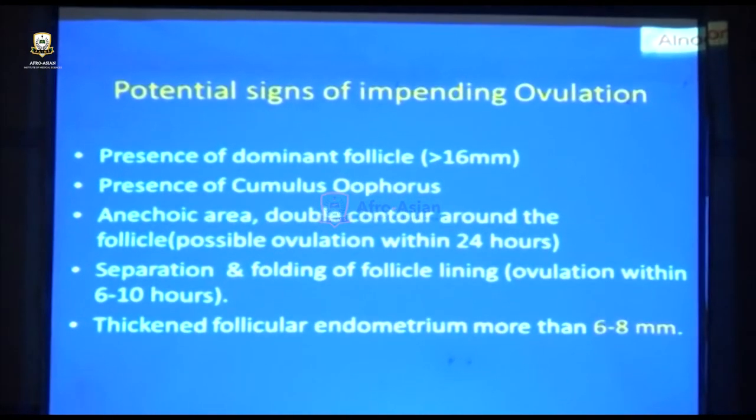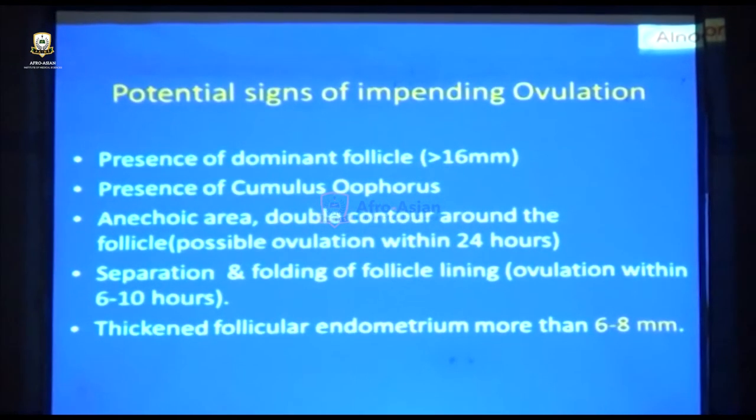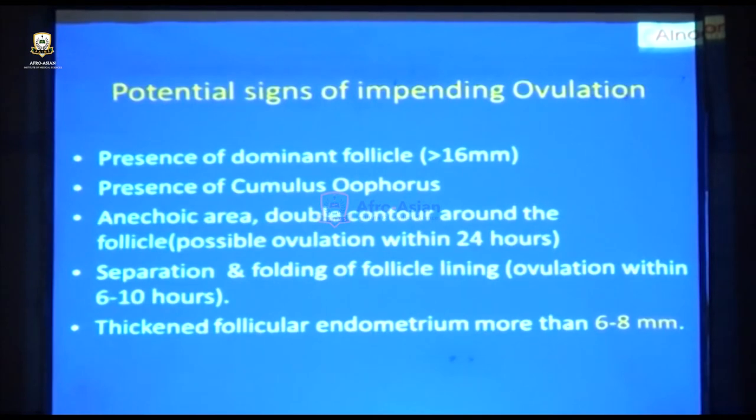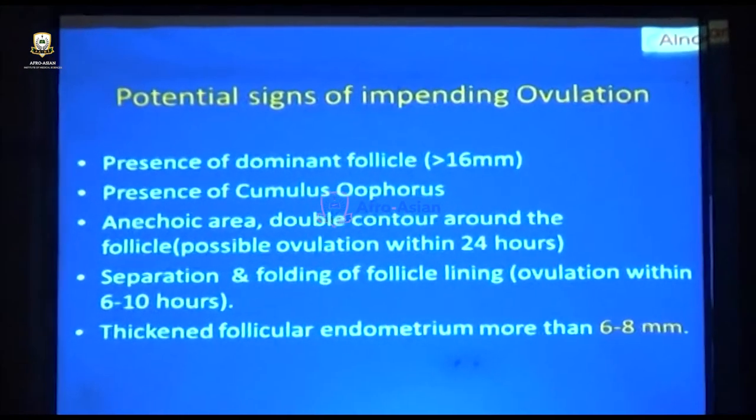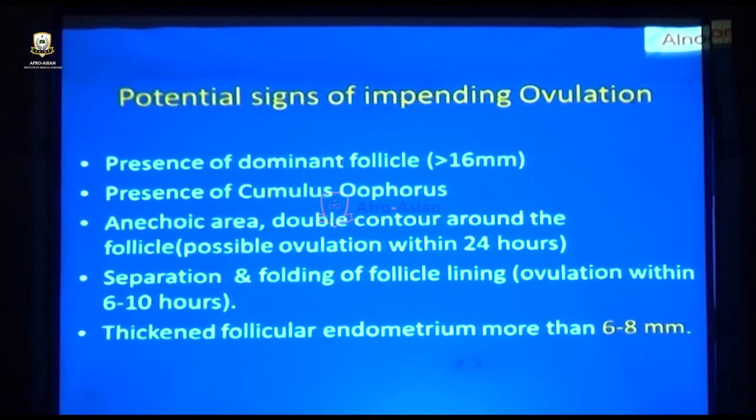Some couples come to you and say, give us one meeting time of a few hours, don't give us 12, 14, 16, 18 days. It's difficult. So by monitoring ultrasound, you can tell them the exact time, within a limit of 4 to 6 hours, when it will rupture. And once you ask the couple to go and meet after rupture, they're going to conceive. Let me tell you, they're going to conceive. Why? I'll prove the science with the next two slides.